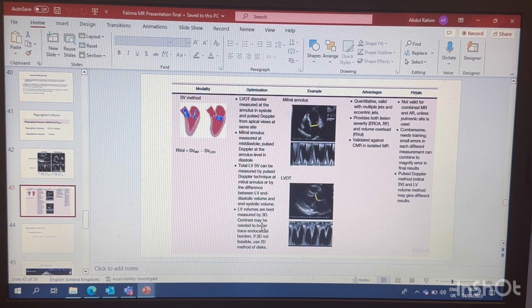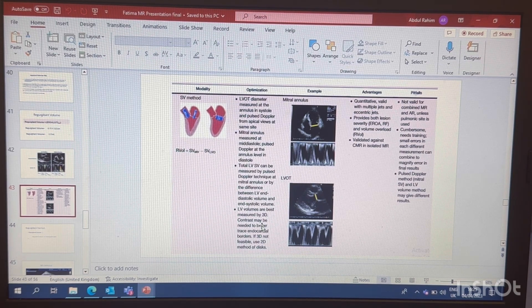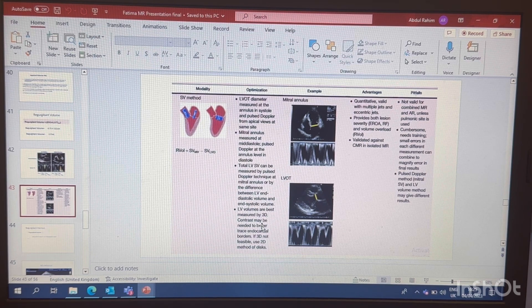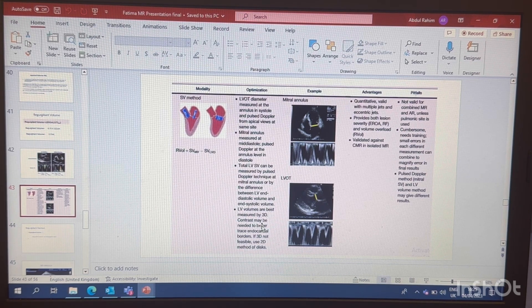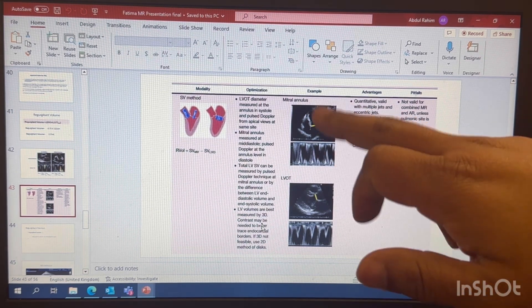An alternative way to get the LVOT stroke volume instead of Doppler is to measure LV diastolic and systolic volumes (e.g., using Simpson's biplane method) and subtract systolic from diastolic to get the LV stroke volume. 3D echocardiography is also mentioned as a good option. You can calculate mitral stroke volume by Doppler and LV stroke volume by Simpson's biplane, then subtract to get the regurgitant volume. The Doppler approach is generally easier.